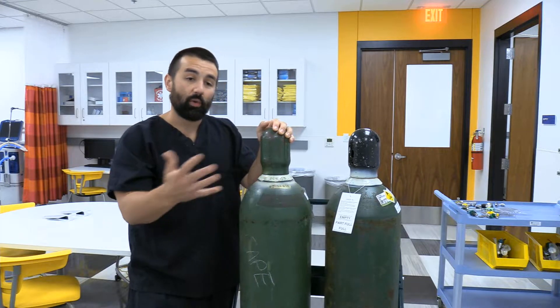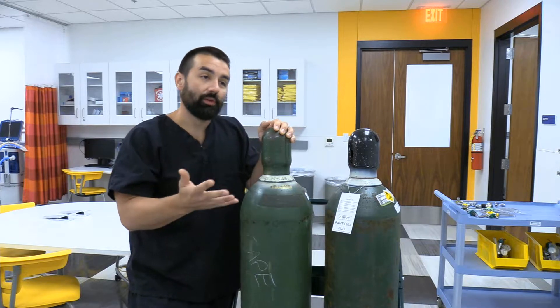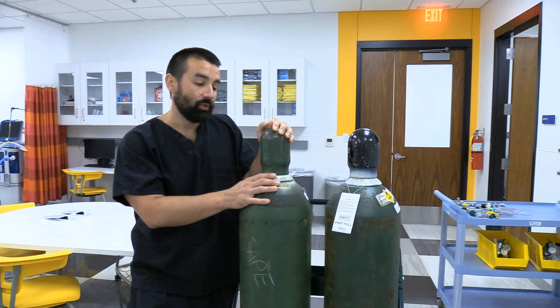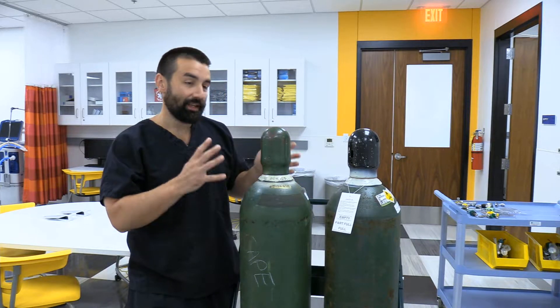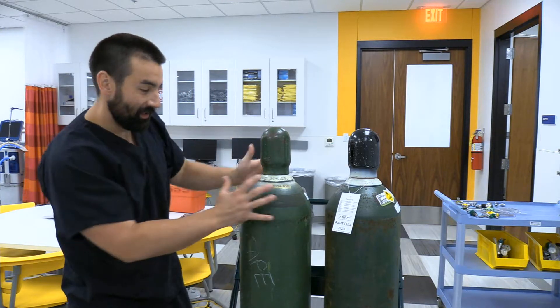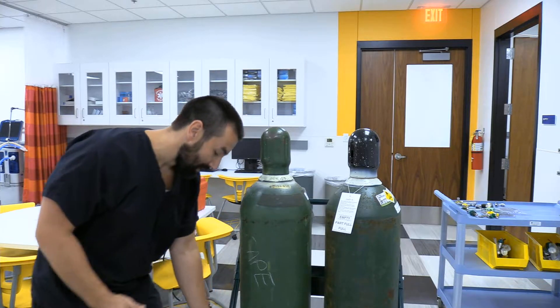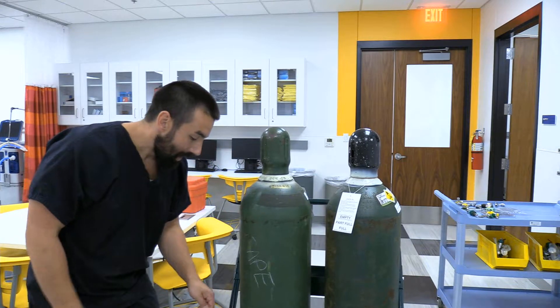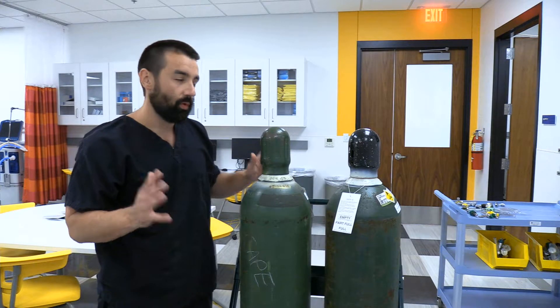Heliox is used for somebody with some sort of airway obstruction — whether that's asthma, a really bad croup, something along those lines — where you're trying to give a lower density gas. The skills are still all transferable, same idea as far as hookup. But you're not always going to be rolling a big H cylinder to a particular area of clinical care.